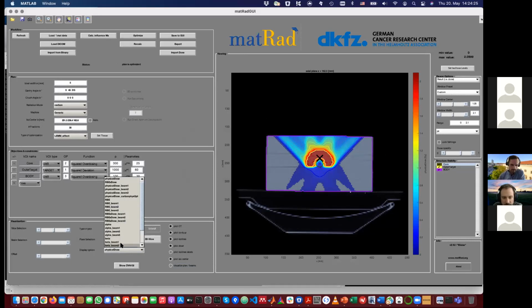So that's often what you see in the context of normal tissue complication models or something like this. So be always careful when you read about BED in the carbon sense. So you don't confuse an RBE weighted dose that gives you the photon dose in a fraction with a dose normalized to 0 fractions, which basically took the fraction out of the equation. Yes, that's just what I wanted to say. Thank you for the comment.